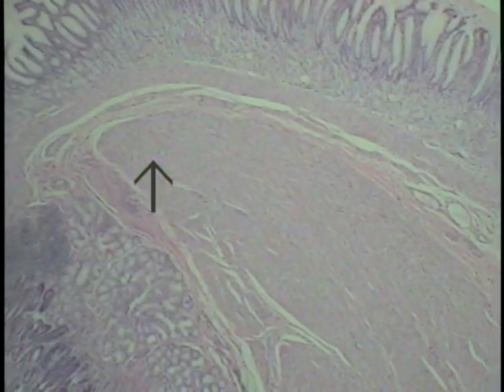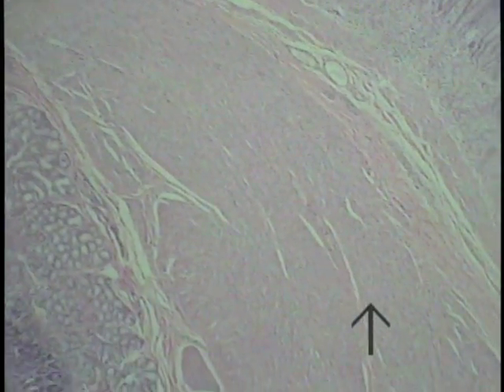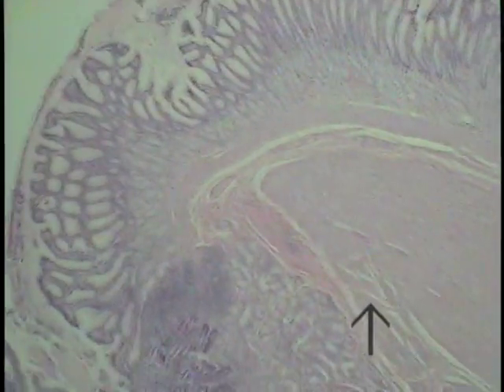And also shown here, in perhaps a more appropriate position, is the pyloric sphincter, that inner circular coil that develops in this particular region. So it has a more proper position, I think, than on the previous section that was examined.